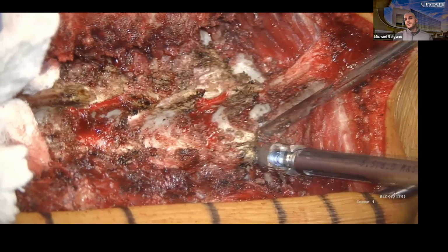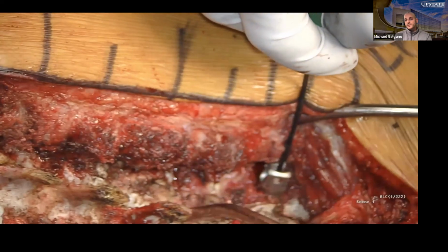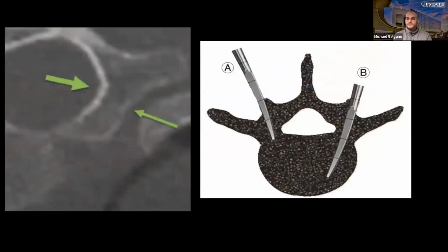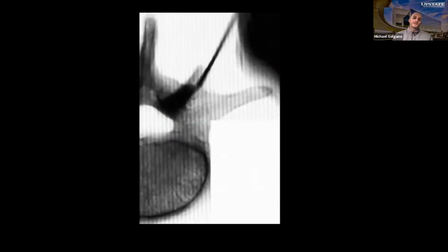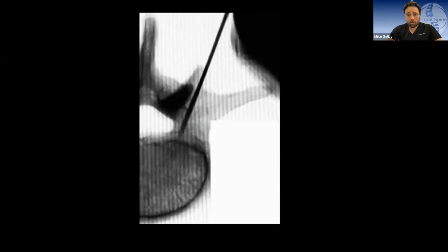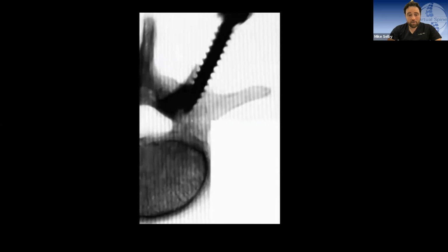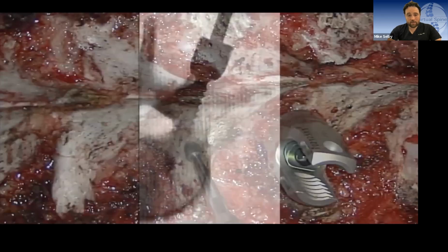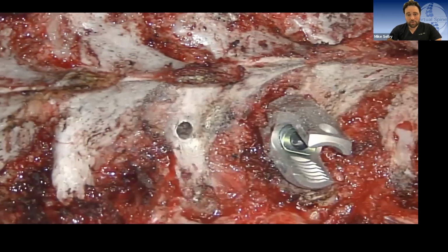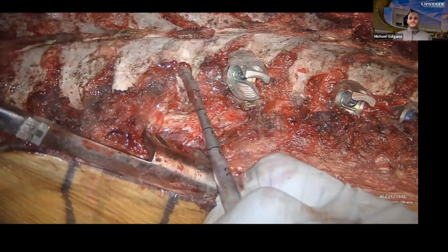Now, I'm not sure, what do you guys do? Do you guys, Mike and Alex, stimulate your screws typically, or do you not? I do lumbar, but I haven't found value in doing thoracic. Yeah. Right. But I cheat now. I used to be like you and use all freehand, perhaps a lot less fluoro than even what Lenke described. But now I use all 7D navigation for this, so I cheat.